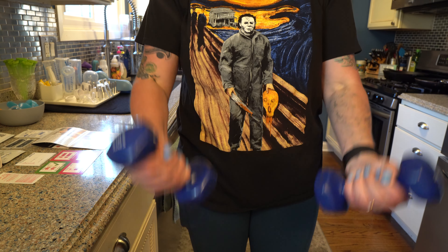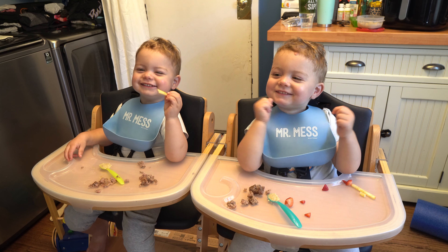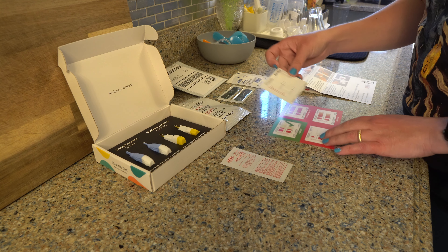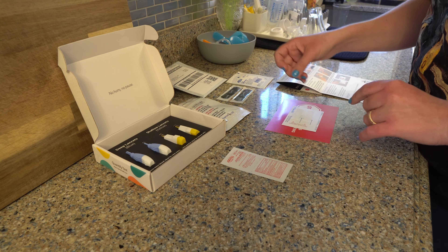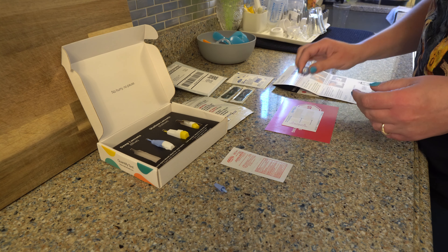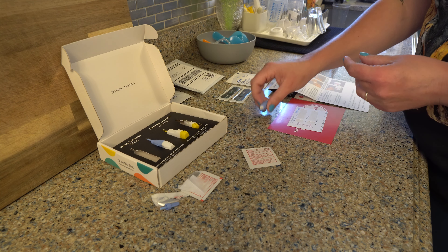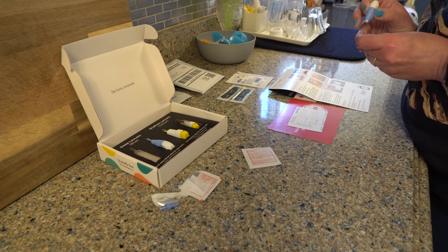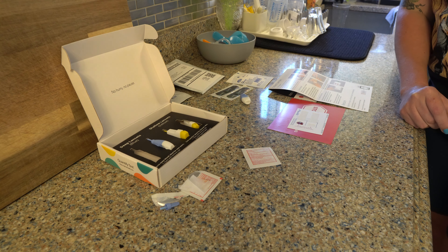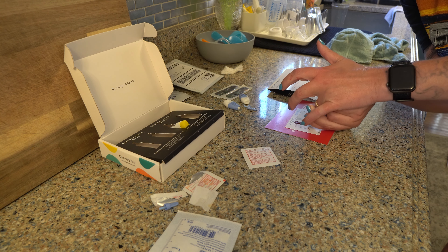Getting blood out of me is like getting blood from a turnip, so I started by doing some bicep curls and spinning my arms a bit. Next, wash your hands. You need to do the test in the morning after you've fasted for 12 to 14 hours, and within one to two hours of waking. Do not consume anything except water. I'd advise stopping supplements for about 72 hours before any blood test. Wipe the sides of your fingers with an alcohol pad, let them dry, then use a lancet on the side of your finger. I like to hold my hand below my heart to get blood to flow better. Each square needs four to six drops of blood — I usually have to lance myself two to four times to get what I need.